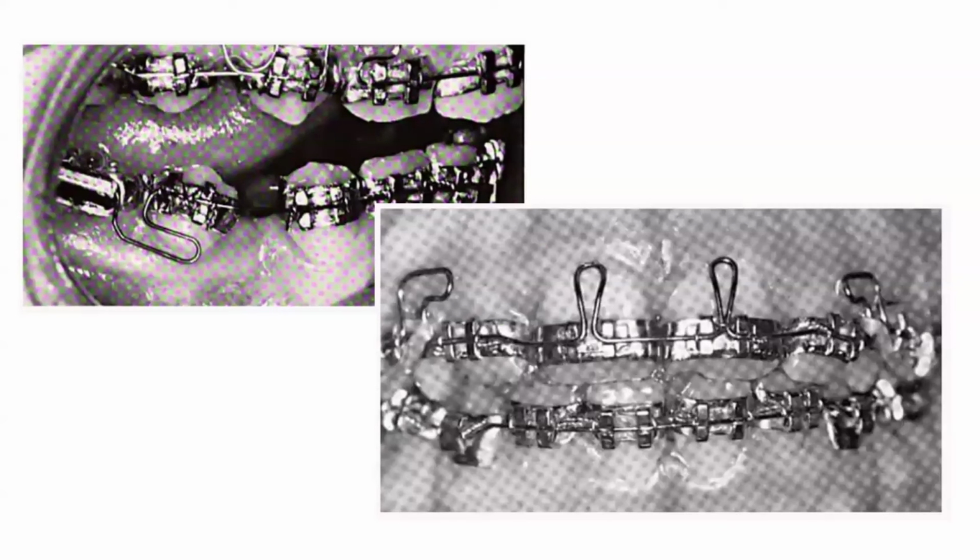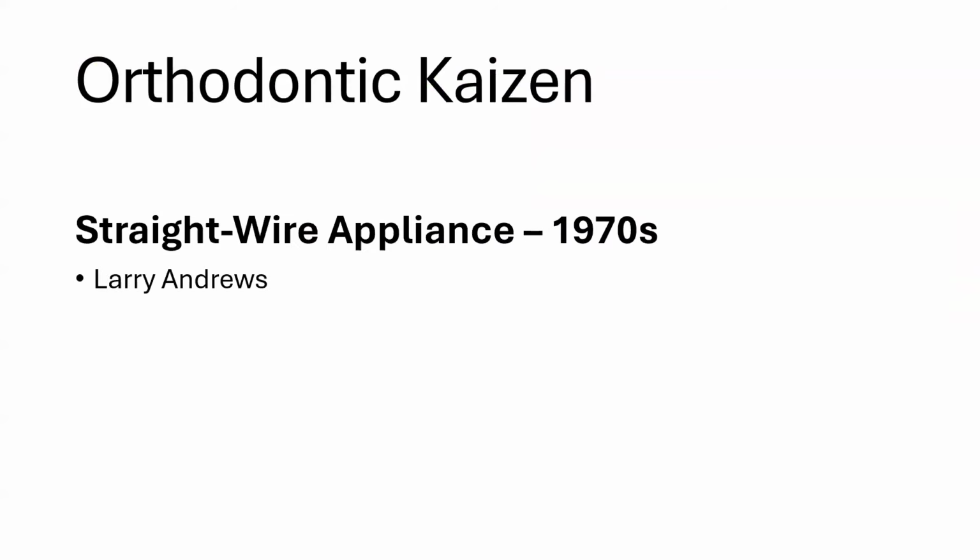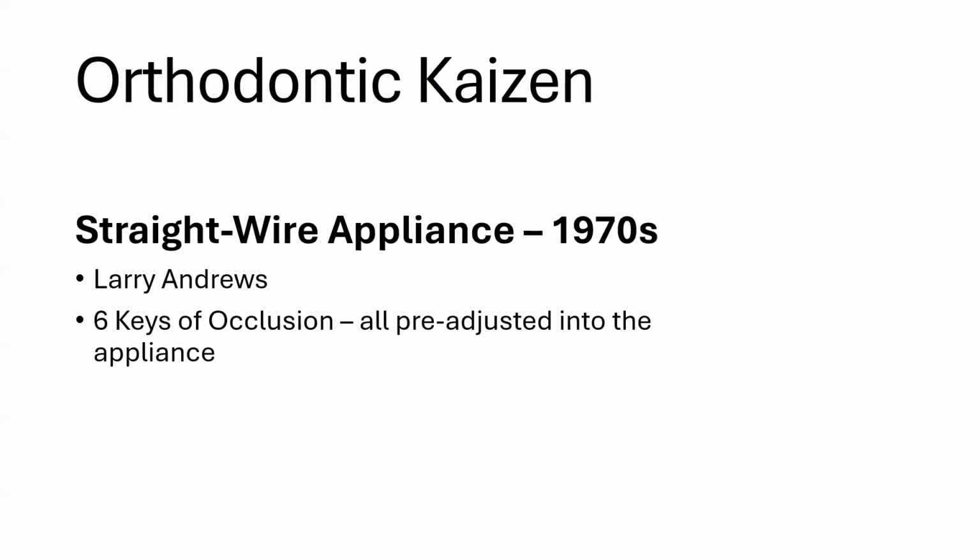And the Edgewise system required a ton of customization. You had to customize the wire in all three planes of space for every tooth. Every tooth in the mouth had the exact same bracket on it. Next, in the 1970s, Larry Andrews came on the scene.